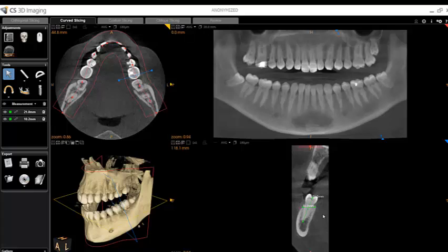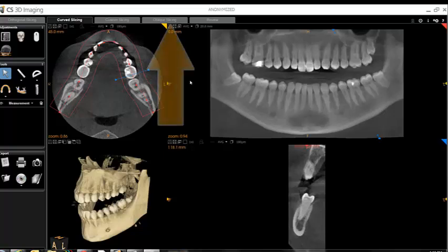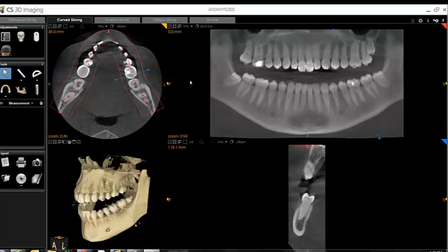You can do as many measurements as you like. Another really useful tool, the oblique slicing tab, allows you to tilt and rotate slice planes to isolate and examine 360 degrees around a region of interest. This is ideal for rotation all the way around a virtually placed implant to evaluate placement and bone, evaluation of root canals that are difficult to visualize, lesion examination and other pathological evaluation, and much more. To use the oblique slicing tab, just click the tab.